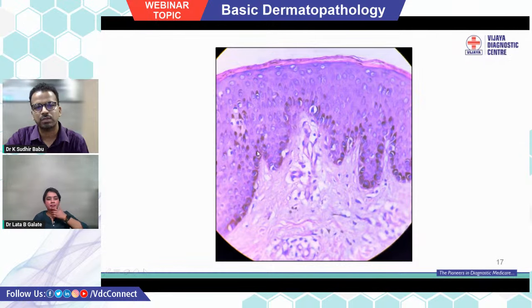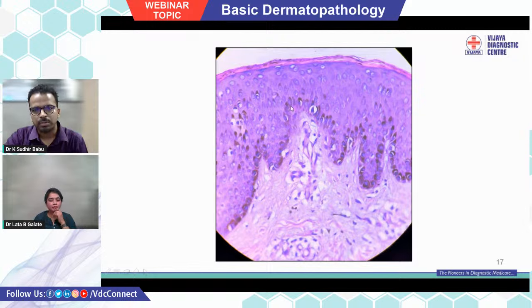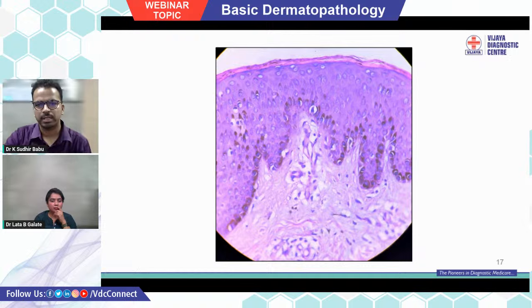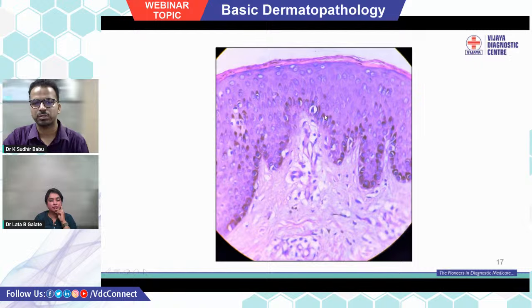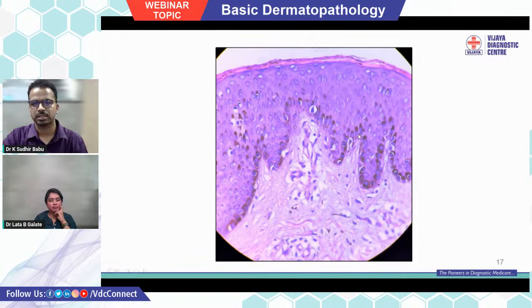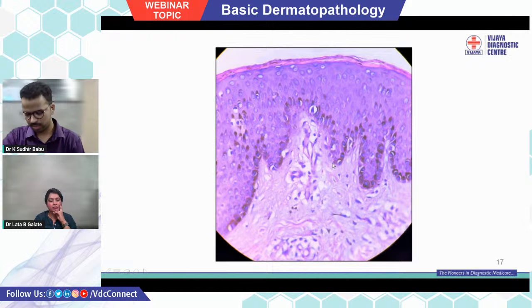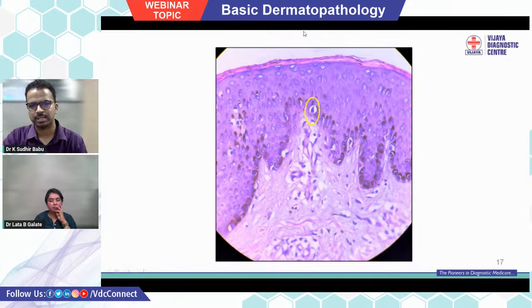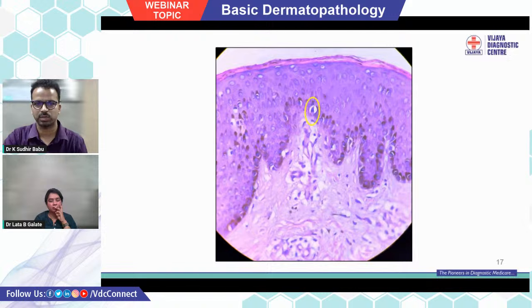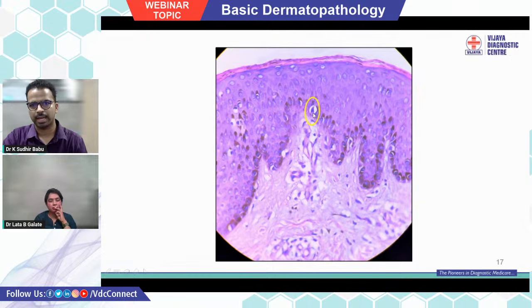In the basal layer you can see brown-colored melanin pigment — appreciate these brown melanin caps located on top of the nucleus to protect the nuclear contents from direct sunlight damage. The basal layer cells also show an undulating appearance — this is the rete ridge. You can also identify one vacuolated cell within the basal layer — that is a melanocyte — so be careful not to confuse it with vacuolar degeneration. In summary, in the basal layer you will see melanin pigment, melanin cap, rete ridges, and a melanocyte.